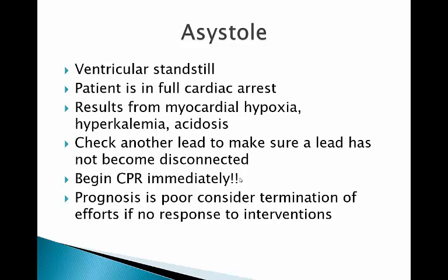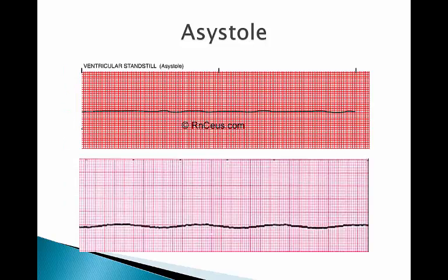Check to make sure that their leads are in place. Check to make sure that they have a pulse, okay? If you see this, and your patient's sitting up and talking to you, chances are they're not in asystole, okay? So don't be throwing the defibrillator pads on your patient going, "Clear," and shock them when they're perfectly fine because one of their leads came loose. All right, so please check the patient and check for a pulse first.